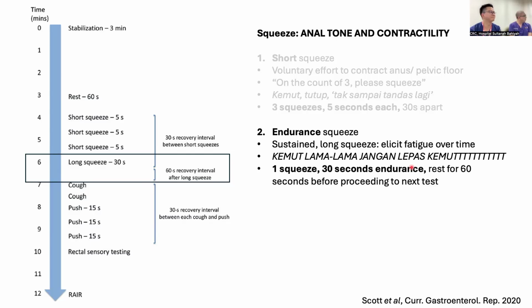Does the position of defecation alter the results? I myself was finding a different way of defecation. Is the position like squatting or sitting? The examination was done while the patient is lying supine, and the balloon expulsion test is done in the sitting position. Yes, correct. How does it work? I'll attempt to answer, and Prof, if I get it wrong, then Prof will take over.